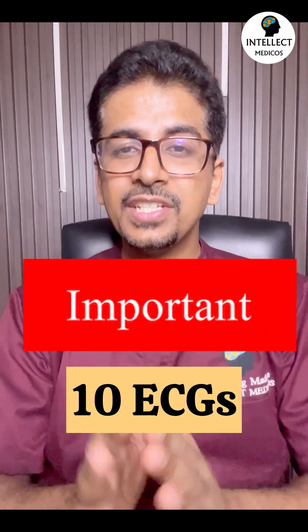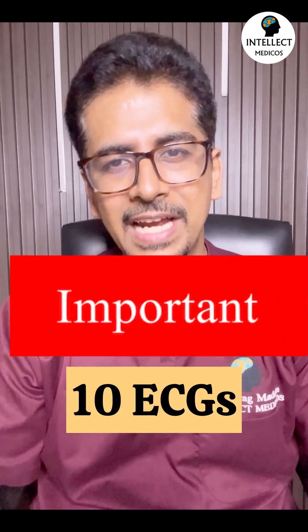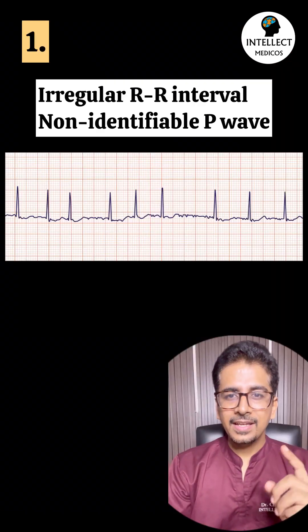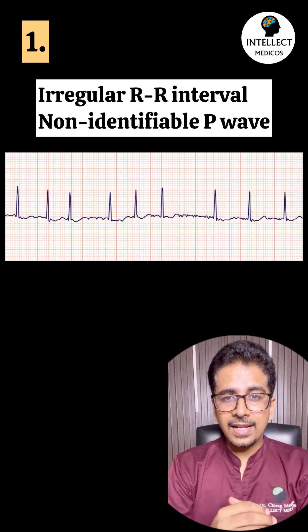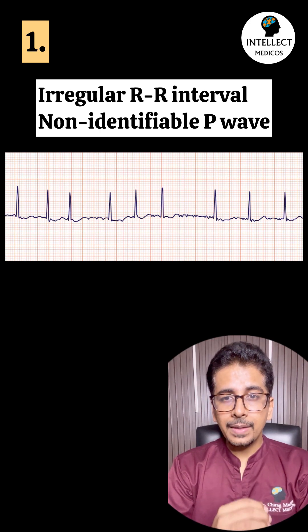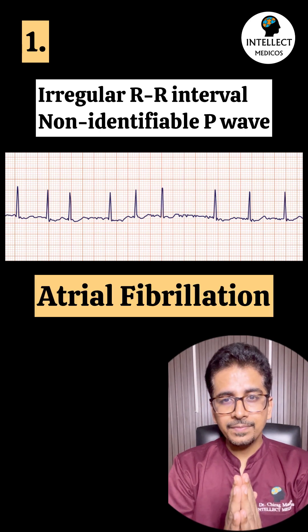These are the 10 ECGs which are very important for your clinical practice and for exams. First: irregular RR interval with non-identifiable P-wave. This is atrial fibrillation.